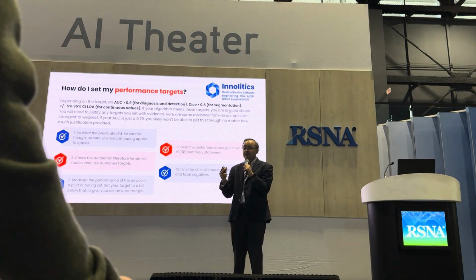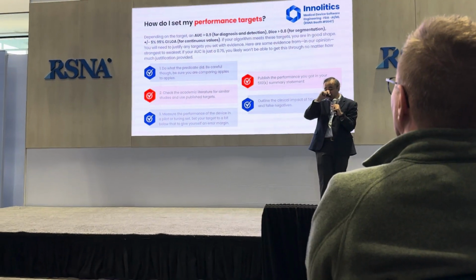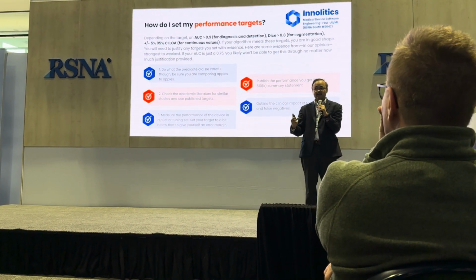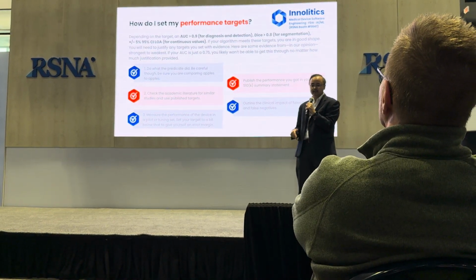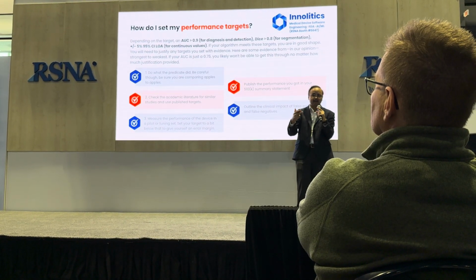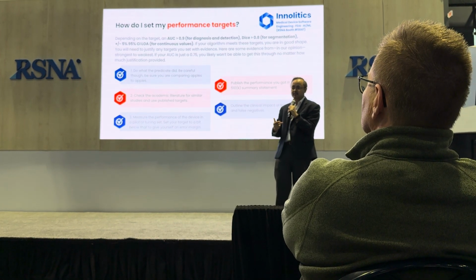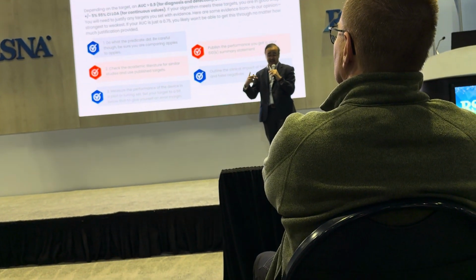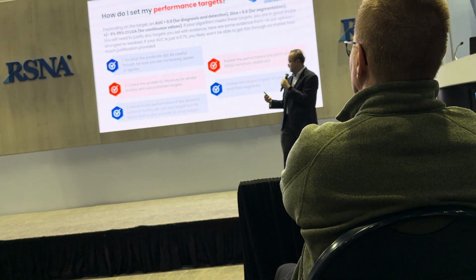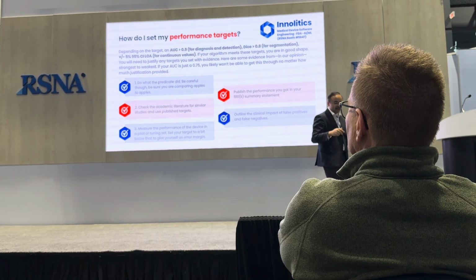However, you still need to justify to FDA how you got these values in the first place. In our opinion, there are 3 tiers of evidence you can use. The first and most preferred tier is to look at your predicate device and see what they did. If they publish performance targets, that's usually a very strong source of evidence to justify why you chose the targets you did. Failing that, you can check the academic literature to see if there are papers published on similar algorithms, and use that as further evidence that your targets are clinically meaningful. And finally, if you have a completely new quantitative imaging value that doesn't have a precedent, you could just measure your device on a pilot set, like a tuning set, and then set your targets to give yourself a little bit of an error margin. But that's the least preferred.